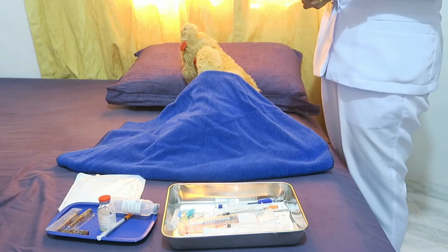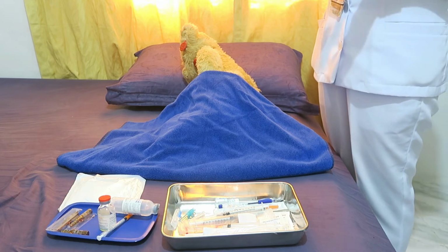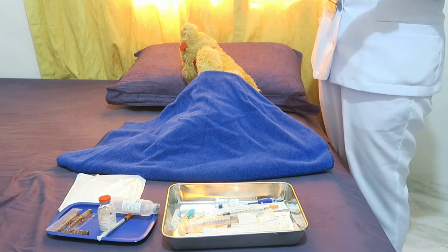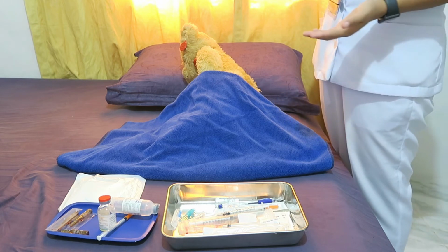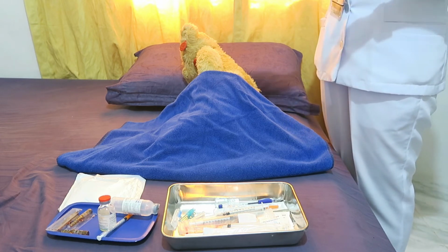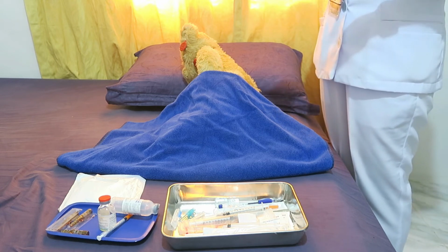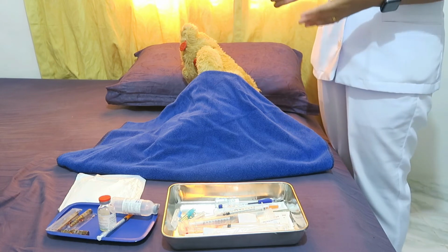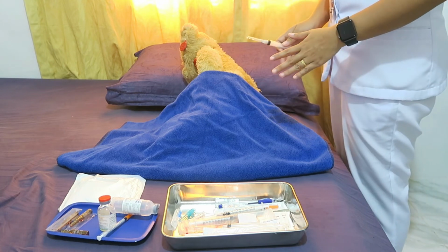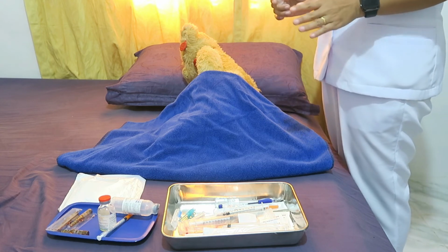After that, inject the medication using the Z-track technique. So, use the ulnar side of the non-dominant hand to pull the skin approximately 2.5 cm or 1 inch to the side. Under some circumstances, such as for an emaciated client or an infant, the muscle may be pinched. The rationale for this is that pinching the muscle makes it firmer and facilitates needle insertion.